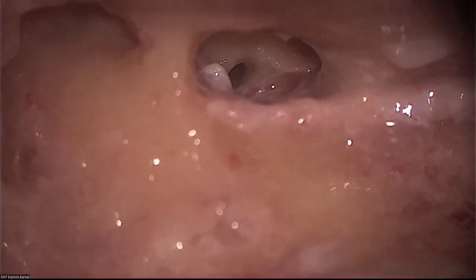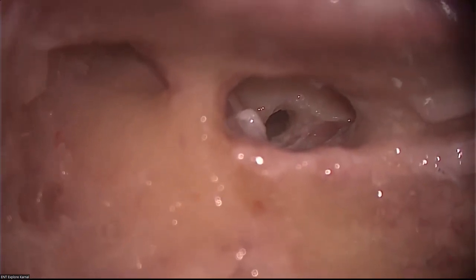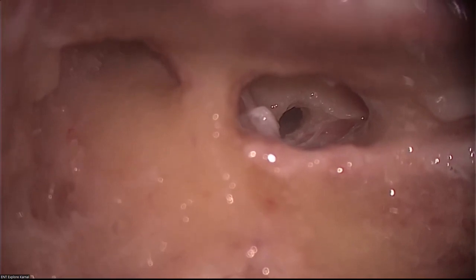Now, this scala tympani is one out of the 3 lumens. Where are the other 2 lumens? To see them, we have to uncover the inner ear further. This is the preferential lumen, the scala tympani, which we want to implant.